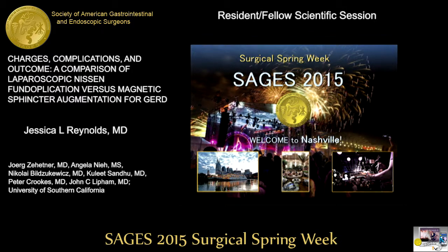Now, of course, this means that the actual cost to the hospital is not necessarily reflected here, because the cost of the hospital is gonna be dependent on what the hospital gets paid, and what the contracts with insurance companies are. But we had to start somewhere at some baseline to compare what the difference may be between these two procedures. So for this study, we started with charges because they are standardized for every patient, regardless of insurance, regardless of self-pay. And we do have a significant self-pay population for the MSA device. Thank you.